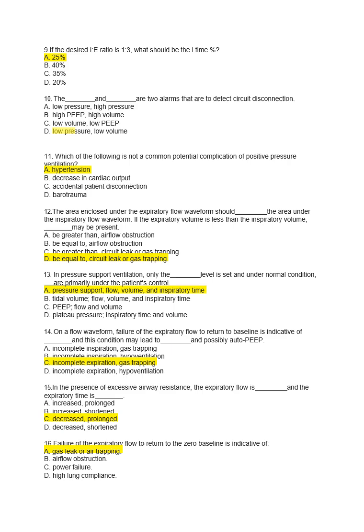So pressure support ventilation is a spontaneous mode of ventilation where all the breaths are patient triggered, and we only provide a pressure support to overcome the resistance provided by the ET tube and the ventilator circuit. The flow, the volume, and the inspiratory time are all based on the patient's trigger and patient breathing.